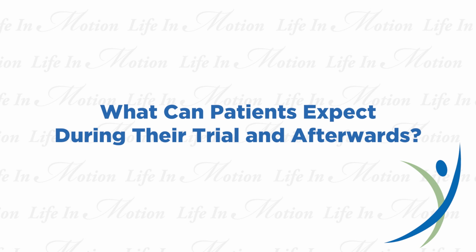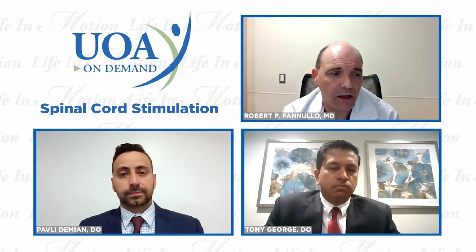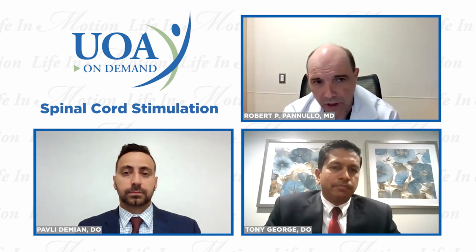Well, as you had mentioned, with the word trial, there's a two-step process. There's a trial and there's a potential implant of the formal stimulator. On the trial, we are essentially placing the lead, or I often with patients call it a wire, that is put into the epidural space and then brought to the therapeutic location. The trial lead is not secured in the back as would be the formal implant. Rather, it is secured externally with the leads attached to a battery, which is put in a pressure dressing in the back. And I like to use an abdominal binder to make sure that it's locked in place because we do not want what's called lead migration.